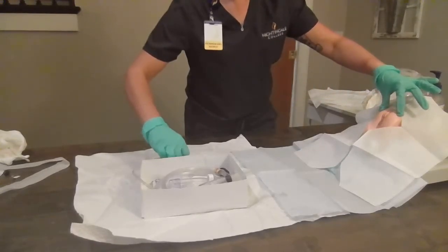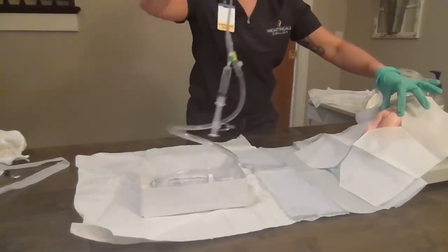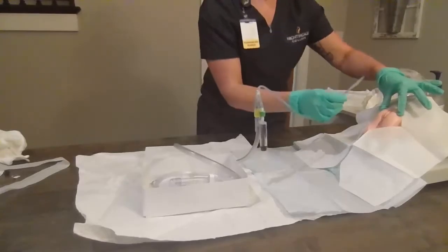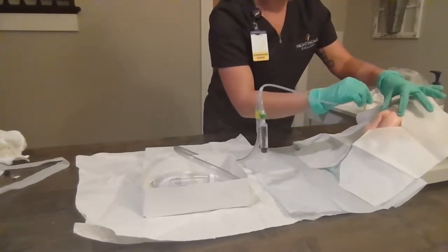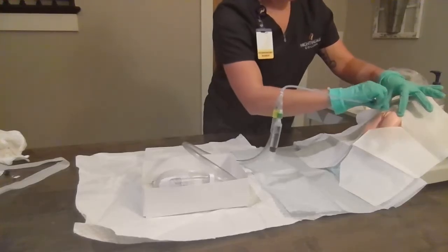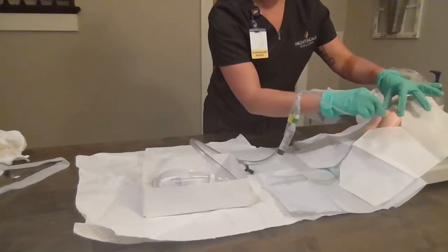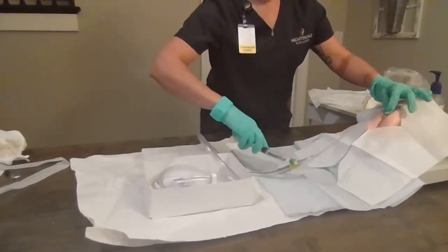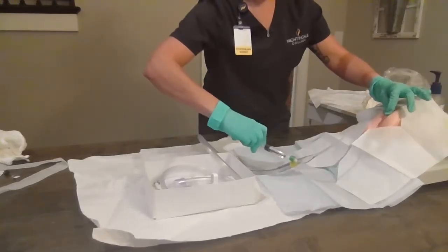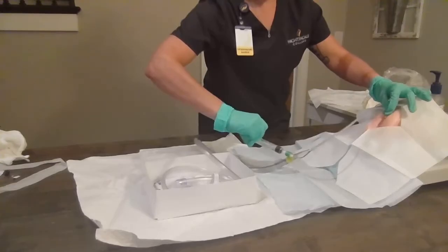I'm going to grab the Foley, two to three inches from the tip. Ms. Smith, I want you to take a nice deep breath; on the exhale we're going to insert. Visualize — we're going to look for urine. When we see urine in the tube, we're going to advance about two more inches. I'm going to hold it with this hand and we're going to inflate our balloon with the full 10 cc's.